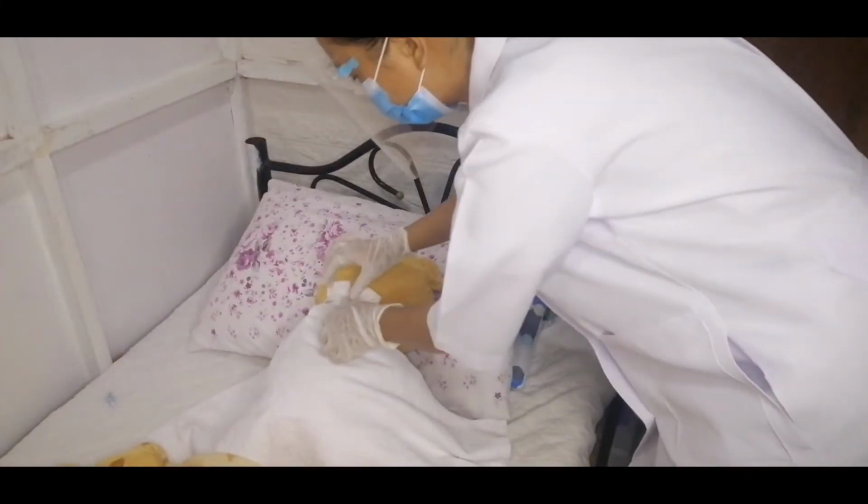Simultaneously, gently slide the trachea pad or dressing downward and discard. Then check for exudate or drainage, skin breakdown, irritation, and inflammation.